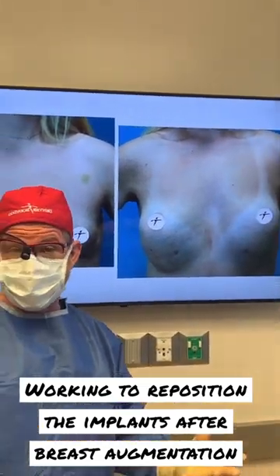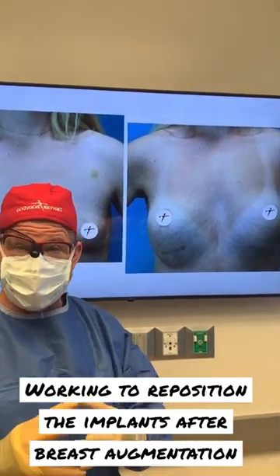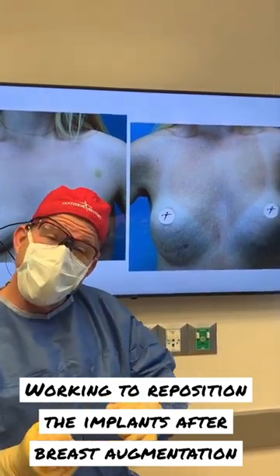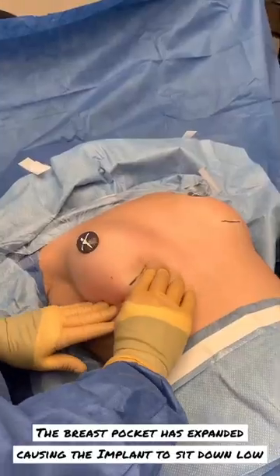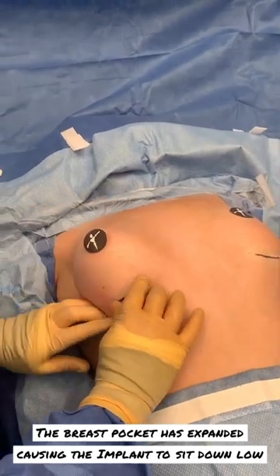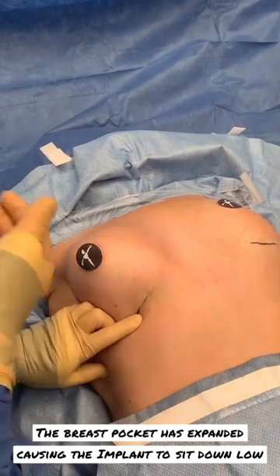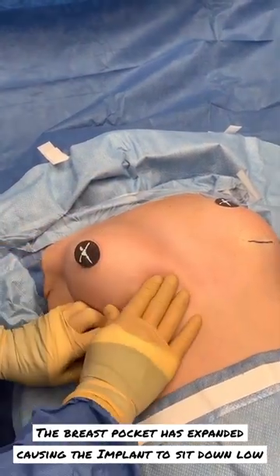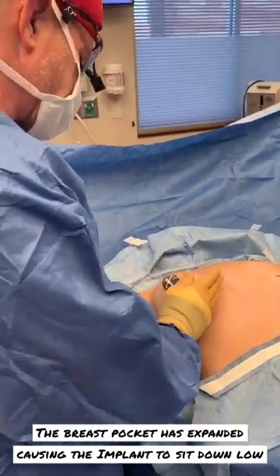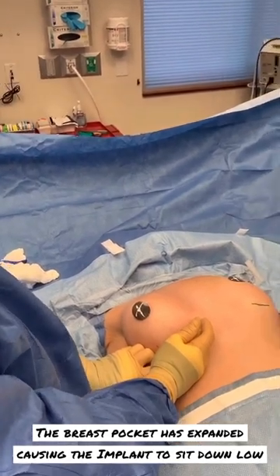One of the issues with breast augmentation when we place an implant is we may need to go make an adjustment or reoperate. That's the case here. We're going to open the pockets up, stabilize that implant position, and really anchor things down. You can see the implant and how it's down low in the pocket. Very, very soft — a very thin capsule is what I'm anticipating. We're going to work to just get it back to that pretty shape, tack it back down. Now that the breast has expanded and accommodated the room for the implant, there won't be the pressure against the implant pushing the position, so we'll re-secure it down. It should be very successful in getting the breast and implant where we want them.